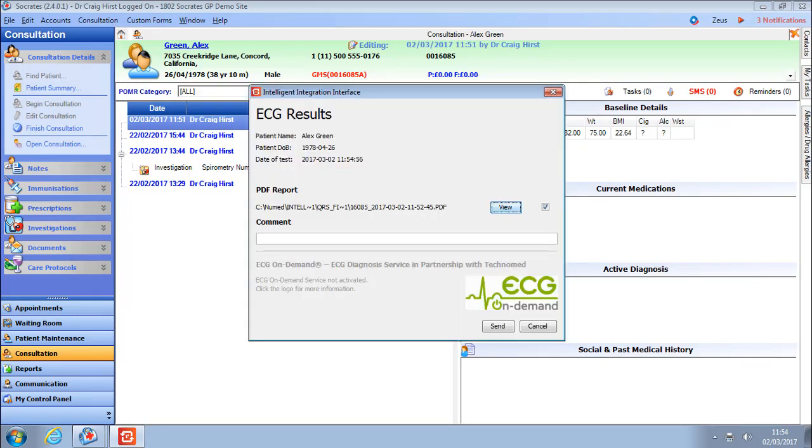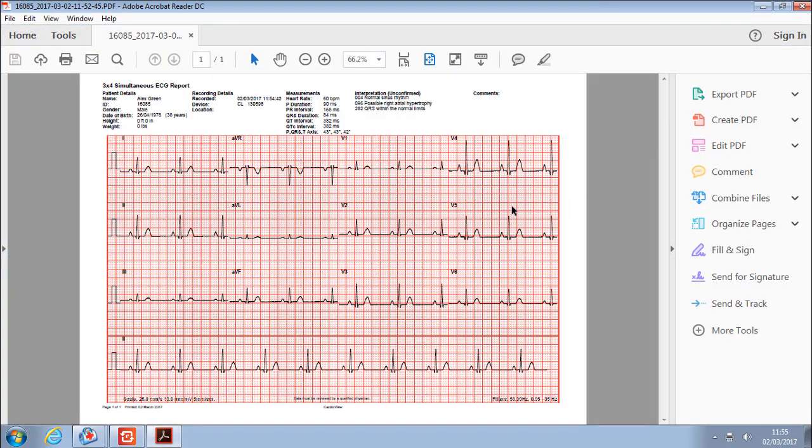This differs from many traditional trolley-based ECG machines, which offer to record for a period of time after the acquisition button is pressed. On the filing screen, you can preview the PDF that will be filed to the Socrates system.